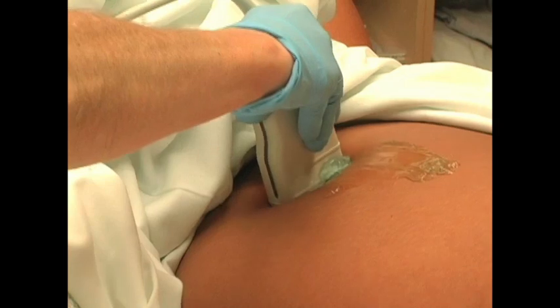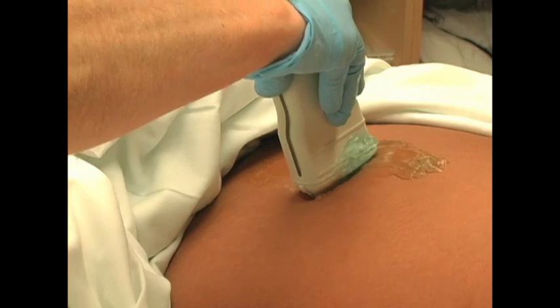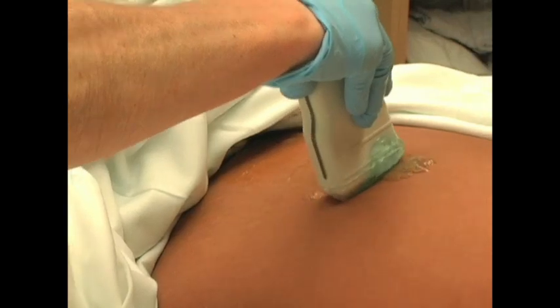Using the same compression-relaxation technique, scan the remainder of the common femoral vein at 1 to 2 centimeter intervals until you are 2 centimeters distal to the common femoral vein bifurcation.